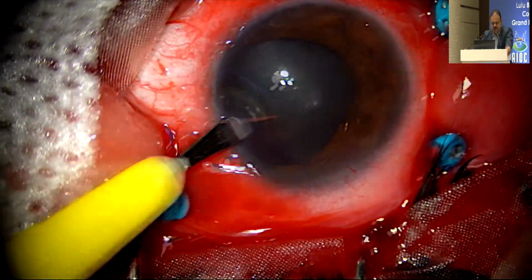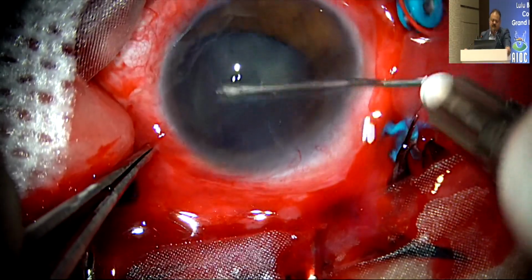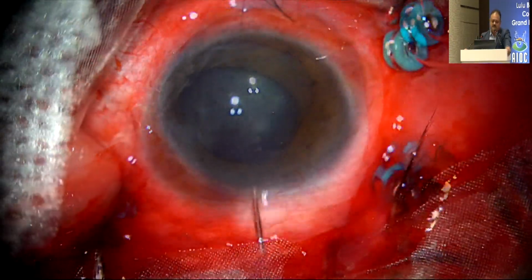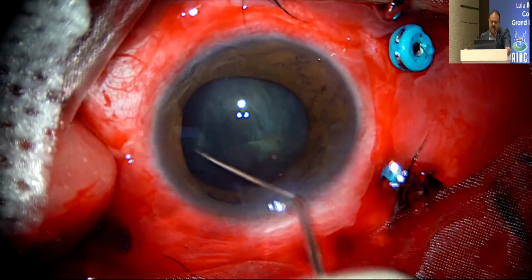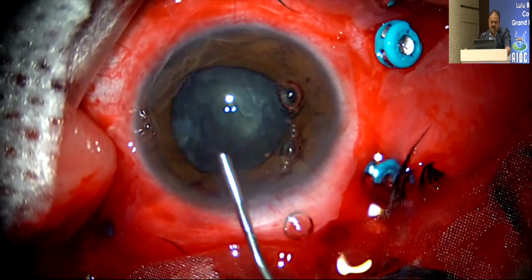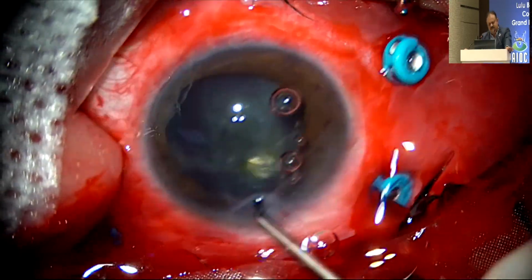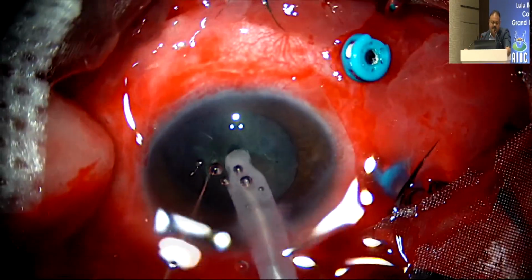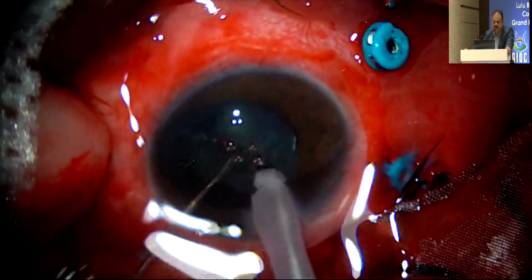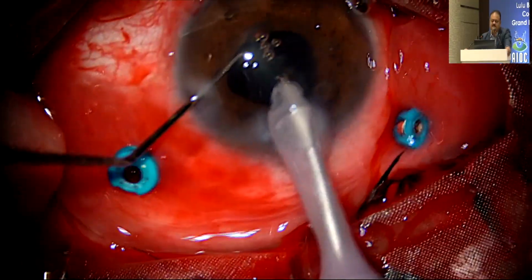Without removing the lens, it was very difficult to approach this case. So we thought we would remove this lens and then go inside. Yes, the option of a two-stage operation was there, but there was a total detachment. Already the patient had come after 7 days because there was some stitch given in the general hospital. So I thought, okay, let's do it in a one-step surgery.